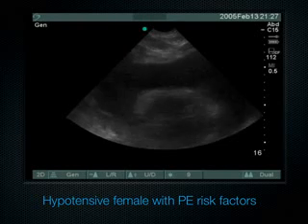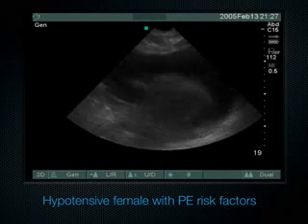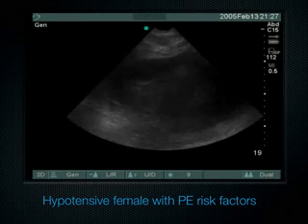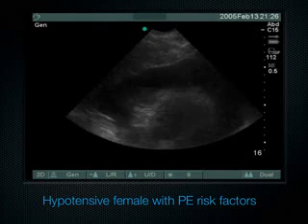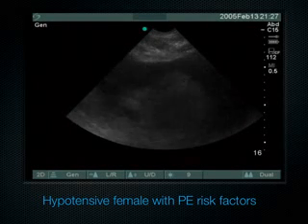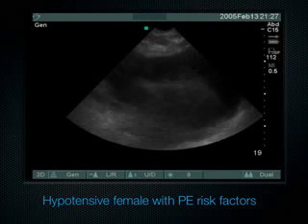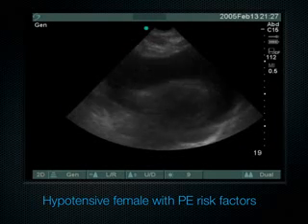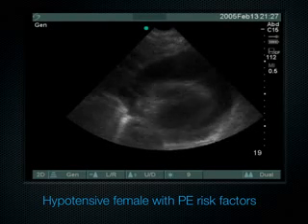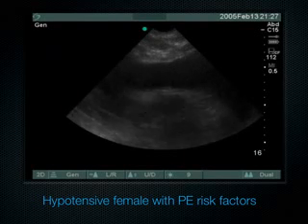Maybe it was just me being a poor clinician, not being able to figure out the difference between PE and tamponade in a hypotensive patient. Or maybe everybody would have struggled with that and been led down the wrong pathway. It really looked like PE to everybody in the room, but we were all wrong, actually. And the ultrasound really saved us from pushing thrombolytics, because then it would have been really difficult to do a pericardiocentesis on somebody we just gave thrombolytics to. We would have had a real problem with the reaccumulation and that kind of stuff.